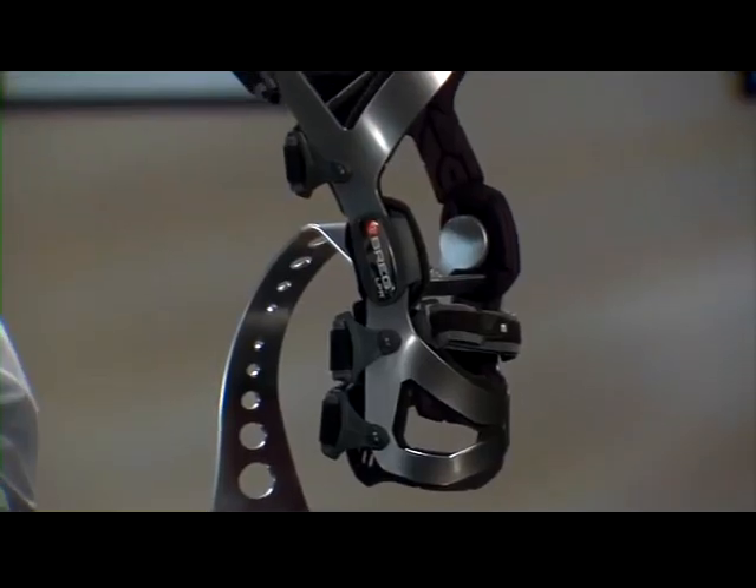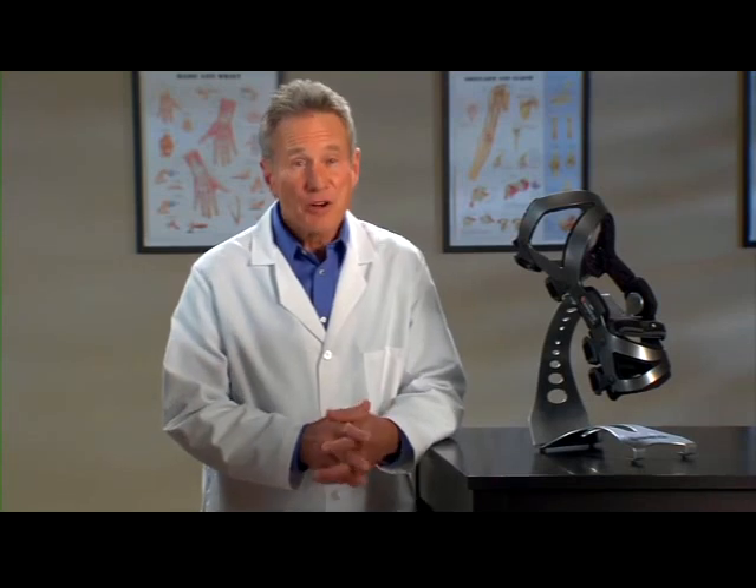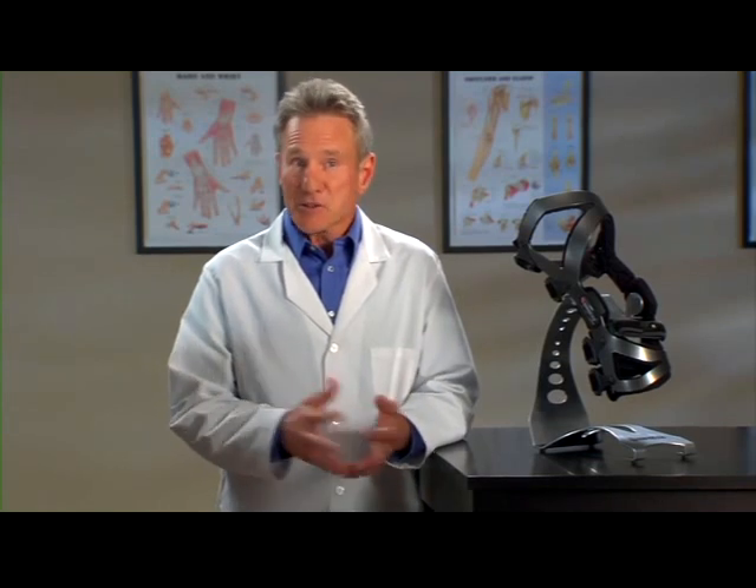You'll be wearing this brace because the LPR is designed to protect your knee by providing rigid support and stability. The LPR was also selected for you because of its comfort and fit. This is important because a brace can provide you with protection, but if it isn't comfortable you're not going to wear it. The LPR is one of the most comfortable yet rigid braces available.